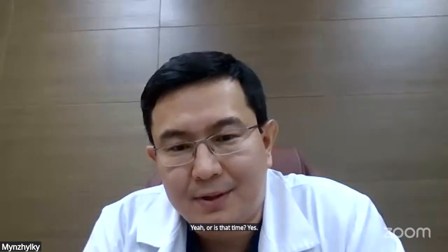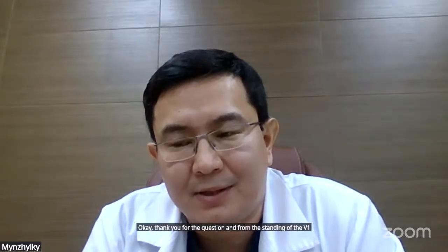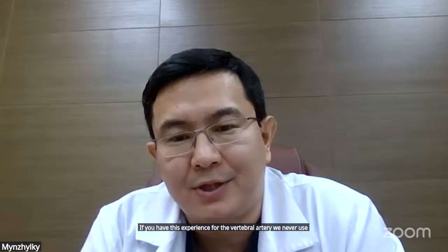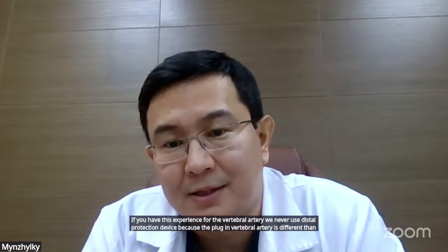Okay, thank you for the question. From the stenting of the V1 segment of the vertebral artery, if you have this experience, we never use a distal protection device because the plaque in the vertebral artery is different from the plaque in the carotid artery.